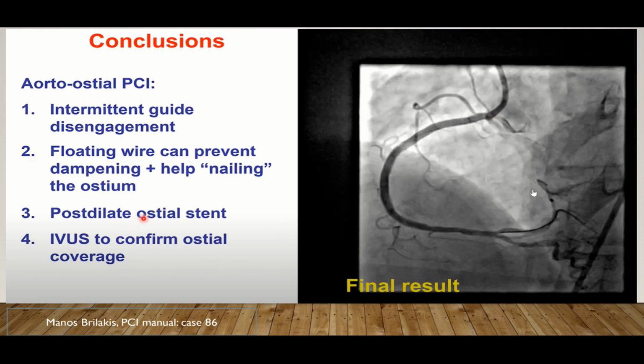Don't forget to post-dilate the ostium of the stent by the flaring we showed you a few seconds ago, and IVUS to confirm the ostial coverage if available.